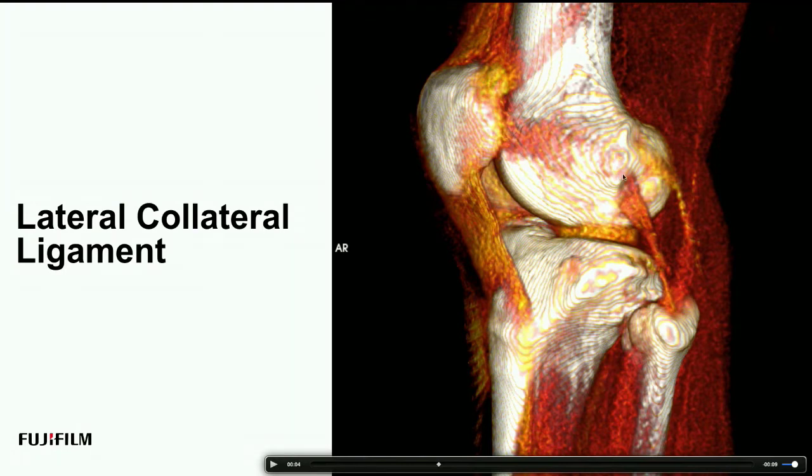So here we have the lateral epicondyle of the femur. Underneath that, not visualized here, is the popliteus groove, diving posteriorly, really. And then we should see a joint line followed by the tibia, the lateral aspect of the tibia. And then we should very superficially see the fibula.